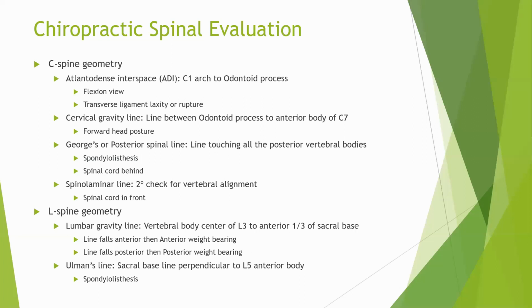I will repeat this one more time. It is extremely important for anyone who does high velocity thrusts. Hopefully you don't just watch YouTube videos and try doing it. It is extremely critical for you to understand the precursor to those techniques. They don't show you how they test it; they just do it. There are protocols that every osteopath and chiropractor follows, and this is part of that protocol. So after you measure the ADI space, if it is less than 5 millimeters, then I do C0, C1, C1, C2 or high-level thrusts for the C-spine.